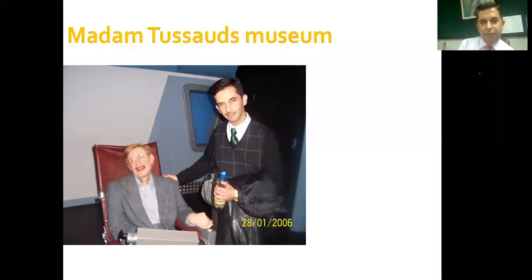So functionally, if it was a radiological imaging modality, the Stephen Hawking would be there. But if it was a functional imaging modality, the chair would have been empty. Because there's no life in Stephen Hawking, in nuclear medicine this Stephen Hawking would not have appeared on the picture. So going a bit further, this was just to give you a brief philosophy of nuclear medicine.